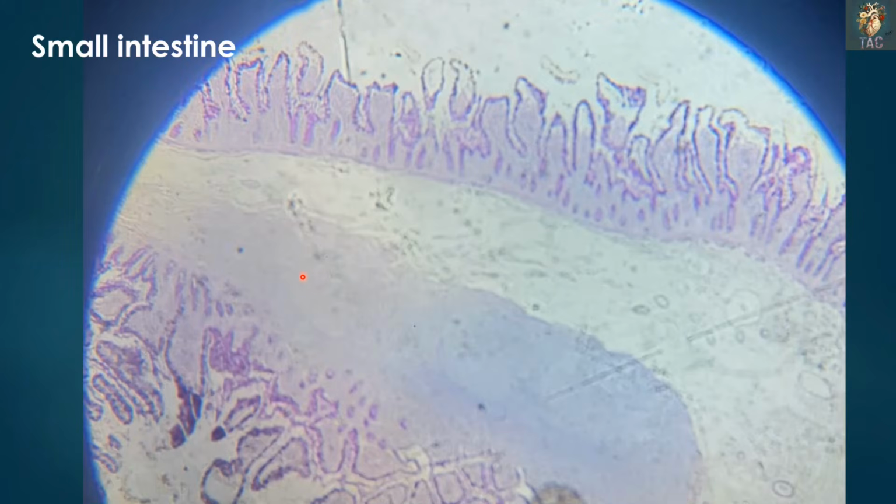So this is the same slide at further higher magnification. Here you can appreciate the different villi which are present. These are the surface modifications. Also the black color shows the goblet cells which are specially stained in this slide. This one is the mucosa, and this is the limit of the lamina propria, and in the lamina propria you can see a large number of lymphocytic aggregates. So this is the slide of the ileum.